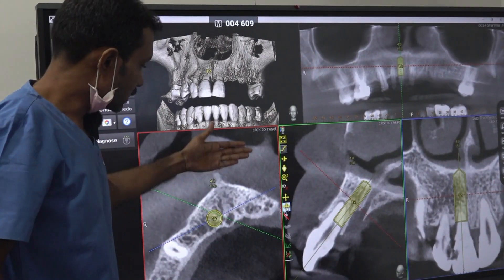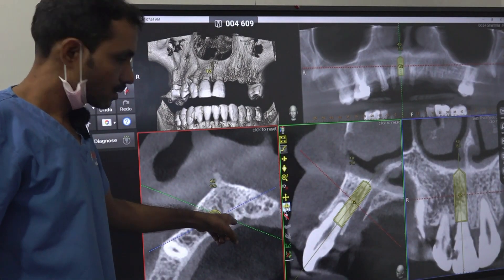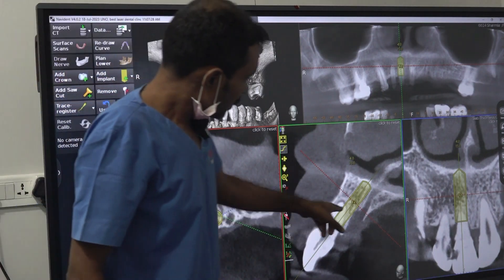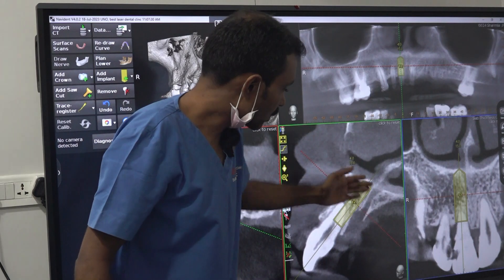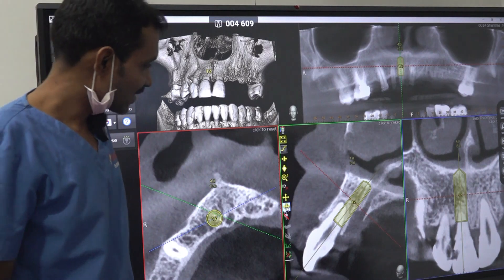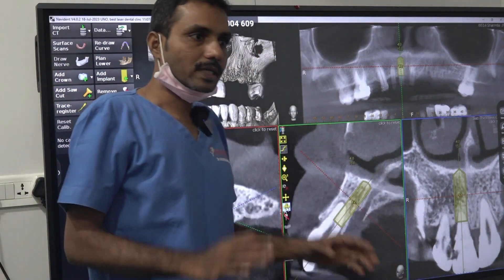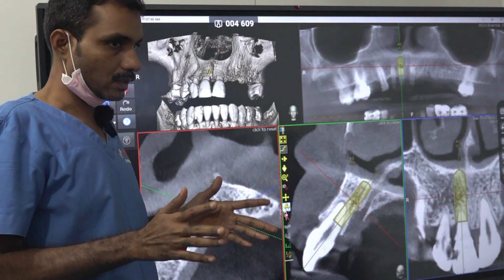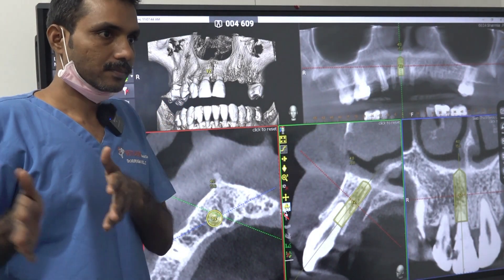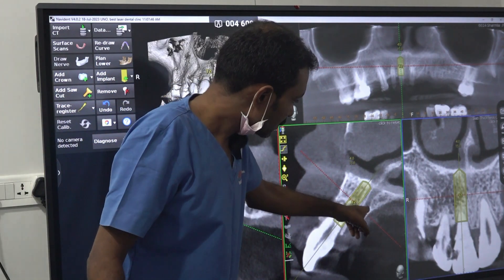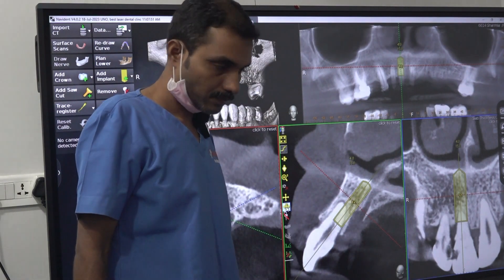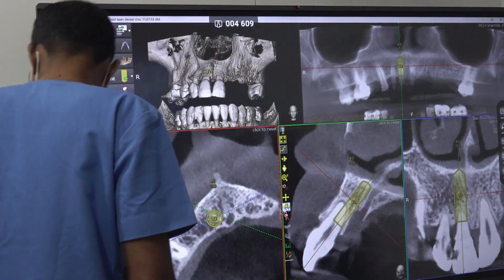This is the axial section — you can see the incisive canal exactly in the midline. This is the buccolingual cross-section showing the canal. There are four types of incisive canal configurations you can observe, as already described in articles — this is something we should read. Sometimes the canal is very wide and comes further forward. But here it is not a major problem.